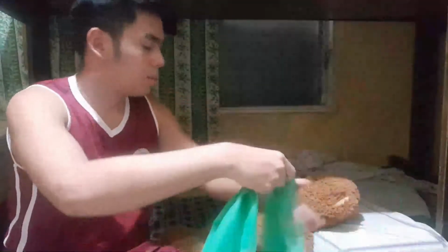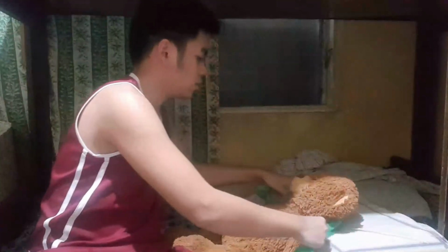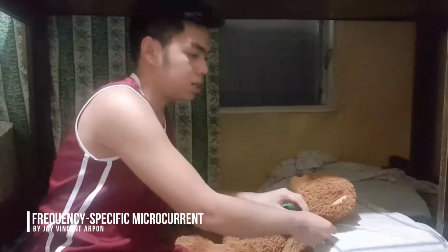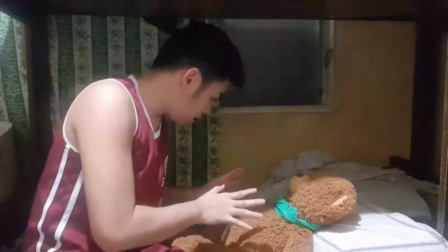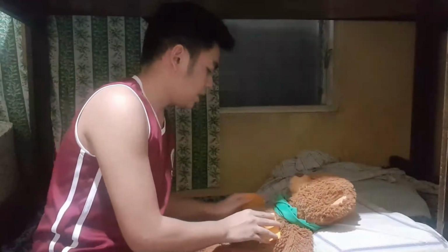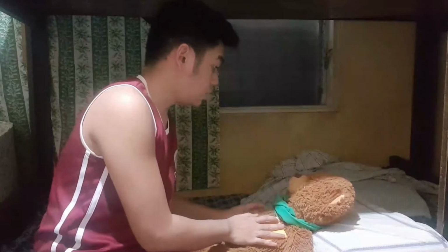So, first, I will be attaching the wet bib. Okay, baby, kaya na. So, attached with alligator clips to the modality. Okay. Then, wait lang, relax na, baby, ha? Ma'am, I will attach na the electrodes, ma'am, ha? Okay, distal to the insertion. Okay. Relax lang, baby, relax.